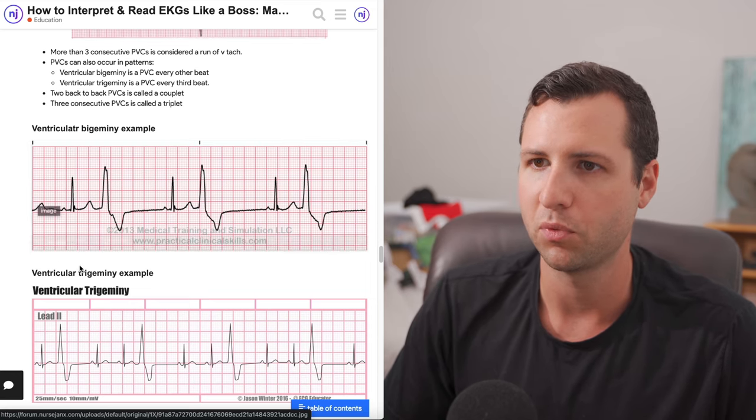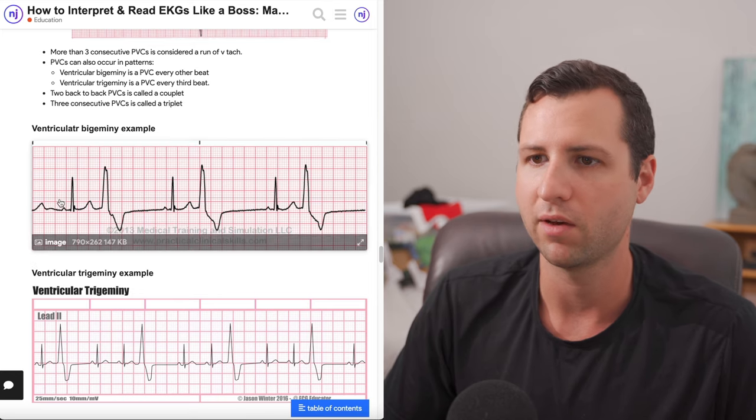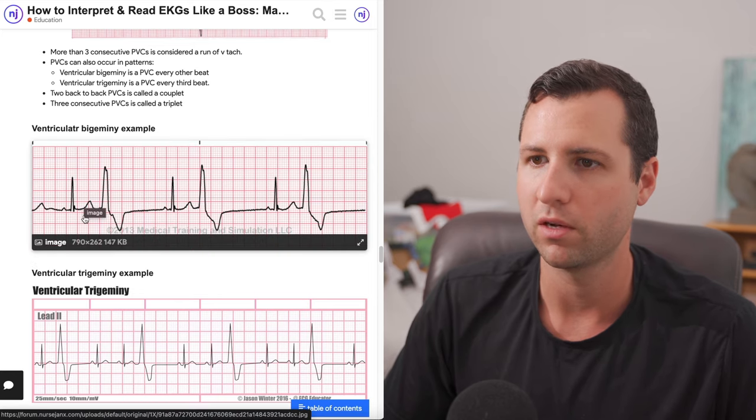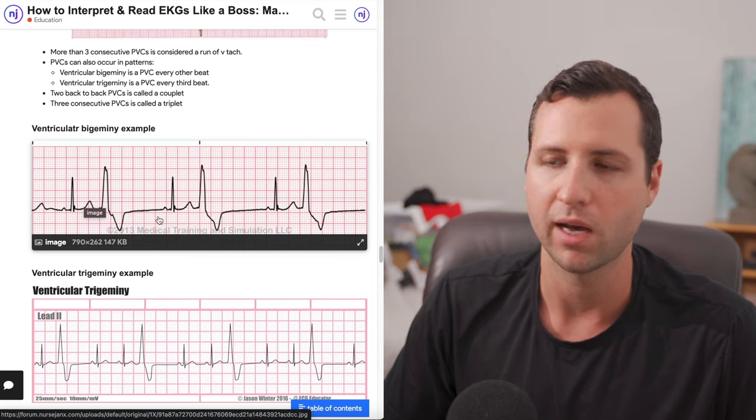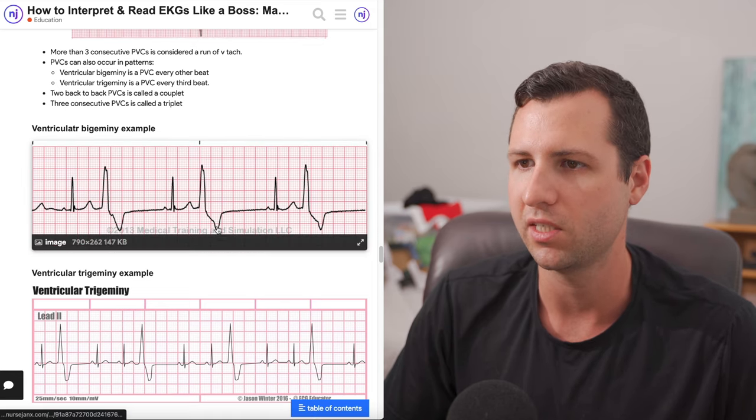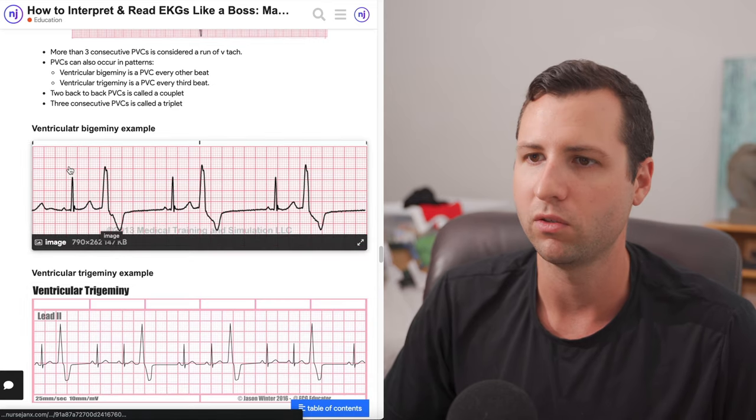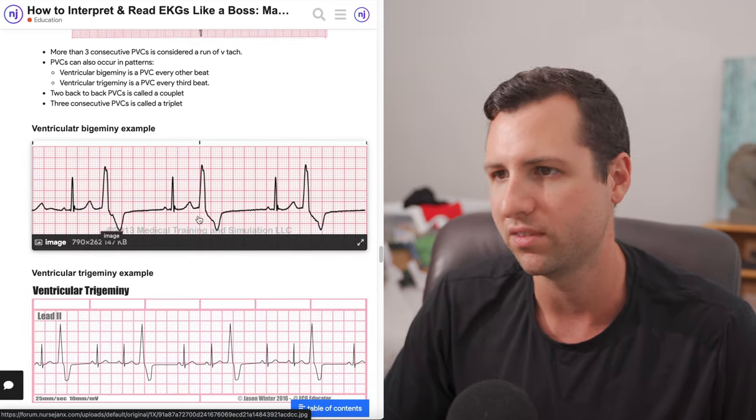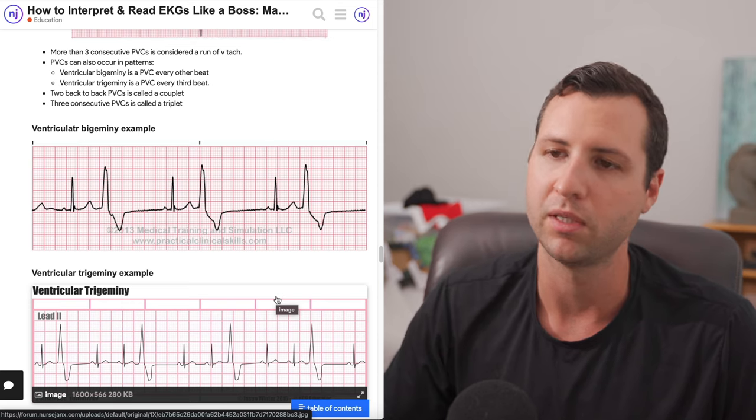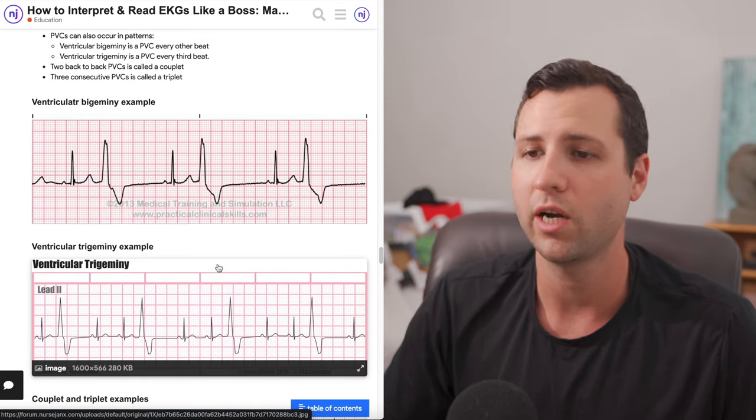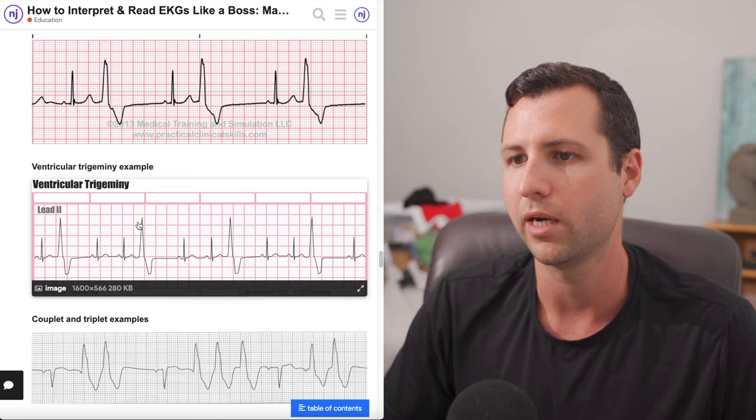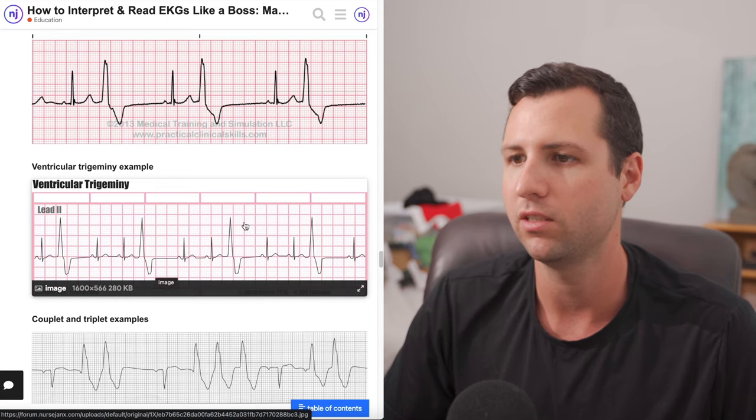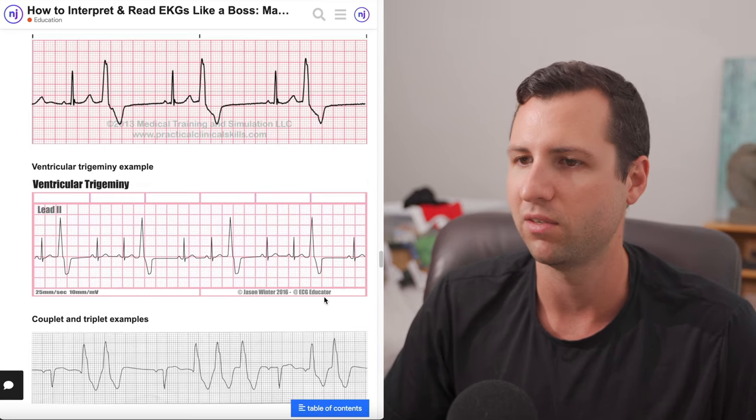This one right here is an example of something called ventricular bigeminy, where we have a normal QRS response followed by a PVC, and it repeats like that. So every other beat is a PVC, and every other beat is normal. Normal, PVC, normal, PVC, normal, PVC. That's bigeminy because it's every other beat. We can also have something called ventricular trigeminy, where we have every third beat. So we have two normal followed by the PVC, two normal, PVC, two normal, PVC, repeating every third beat as a PVC.